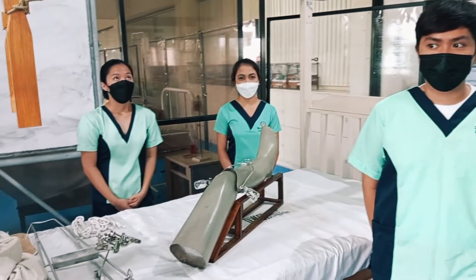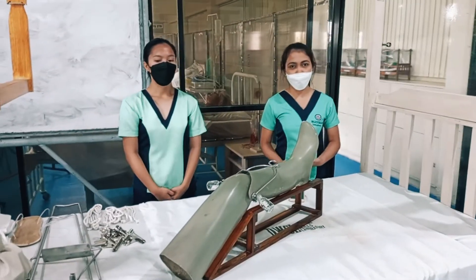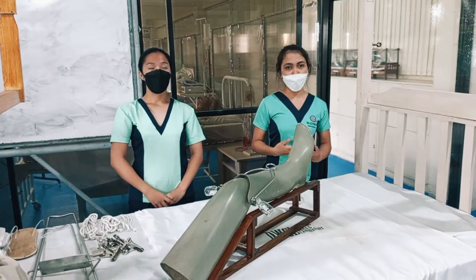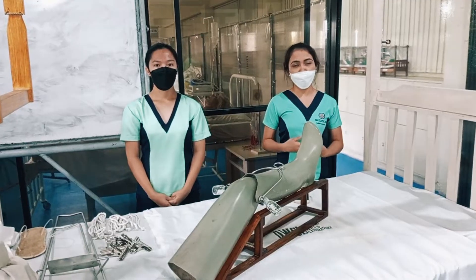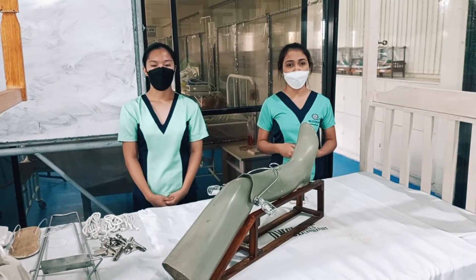The purpose of traction is to provide immobilization, to reduce pain and muscle spasm, to prevent further deformity, to maintain good body alignment, to reduce fractures, and of course, for support.